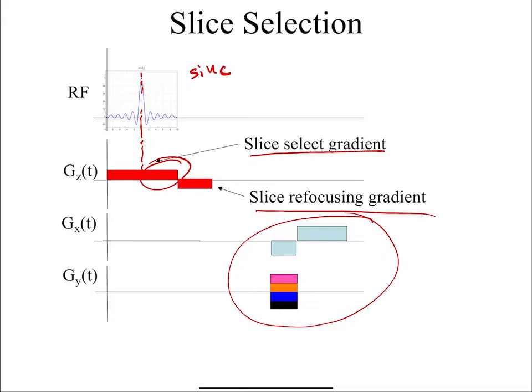Question: can you say again why you're not taking into account the first part? To give you the full answer, it would be another lecture, and if anyone really wants to know, I'm happy to give a supplementary lecture, so let me know. The idea is that intuitively, the sinc pulse goes on for this time, but most of the effect happens where it's really big, and all the other parts sum up to cancel everything else out. As a first approximation, you can think of it as happening mostly at its peak. So if I tip all the spins at this time, let's call it T0, and I apply this gradient, that's going to dephase the spins, so I need to rephase them. That's the simple explanation. I'll give you a sense of what the full explanation looks like in a few slides. But just to introduce you, when we show MRI pulse sequences, you'll often see something like that.